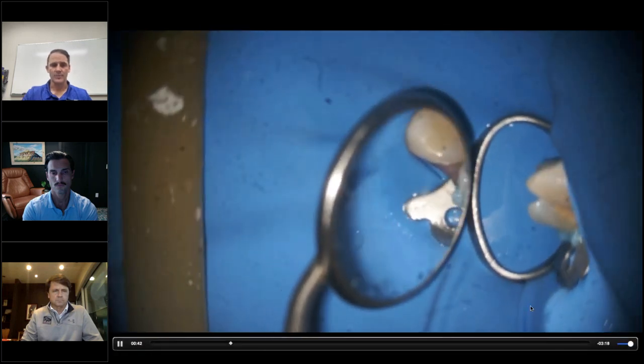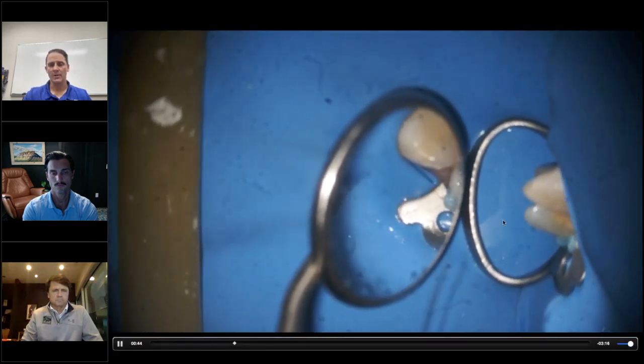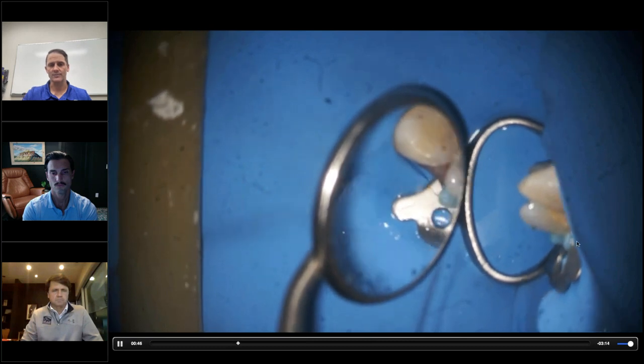My assistant's keeping my mirror clean so I can see. So you're going down to mid-root, and then you're slowly withdrawing the fiber, roughly 1 millimeter per second. And then when I come out, and I'll show you again in another video, you're going to hold the fiber right at the canal orifice.